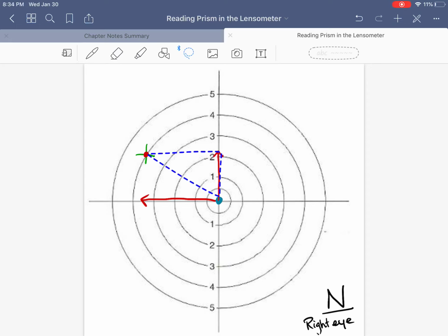I'm not going to go into all the theory of it, but that's kind of how it gets measured right there. In theory, that's kind of what you're doing with finding the vertical and the horizontal squares, the root, that thing.